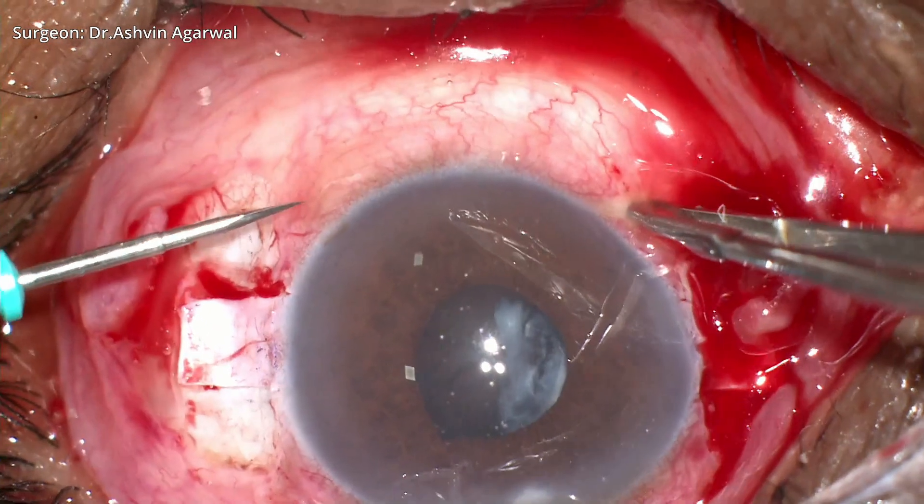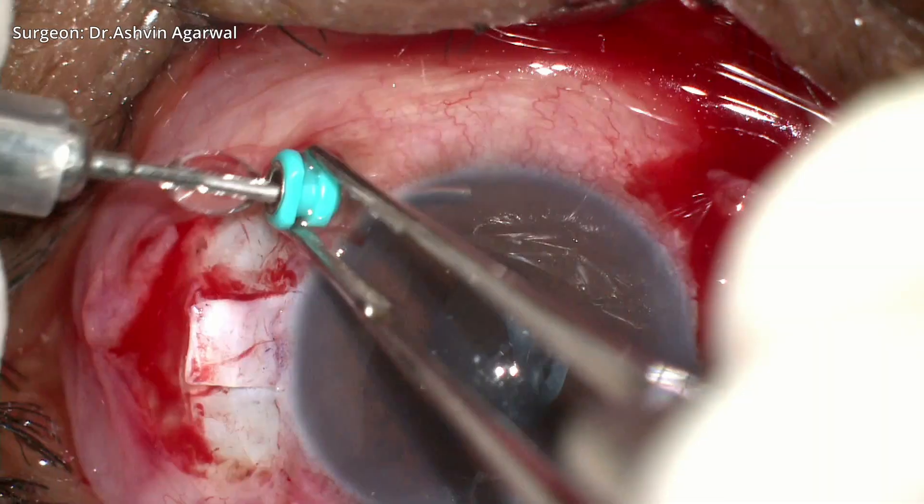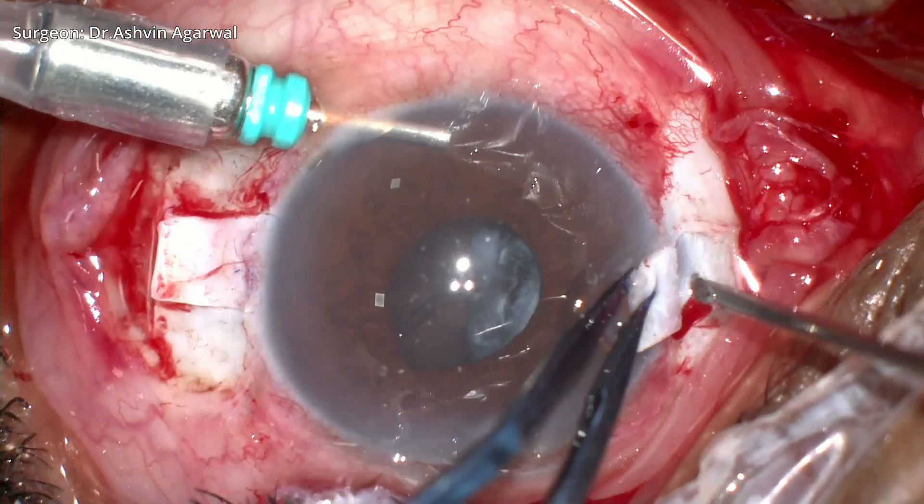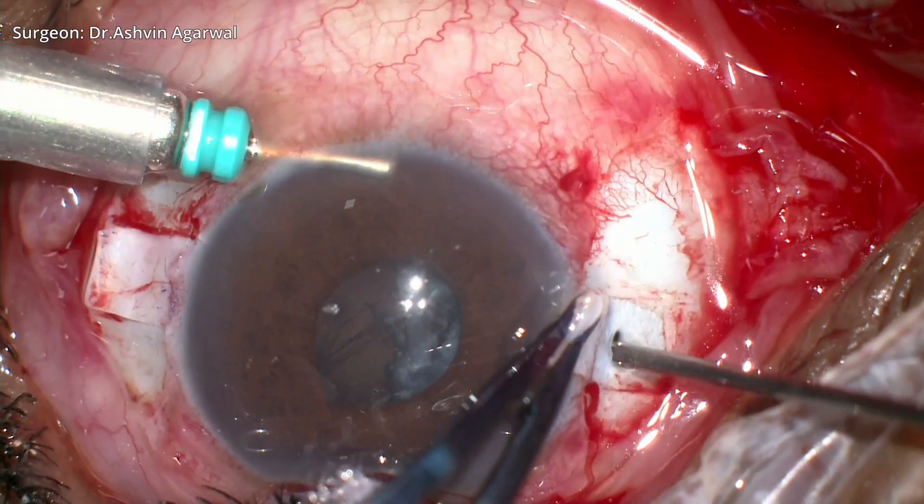An atrocar anterior chamber maintainer is inserted 0.5 millimeter behind the limbus. A 22-gauge needle is then used to make the sclerotomies on either side.